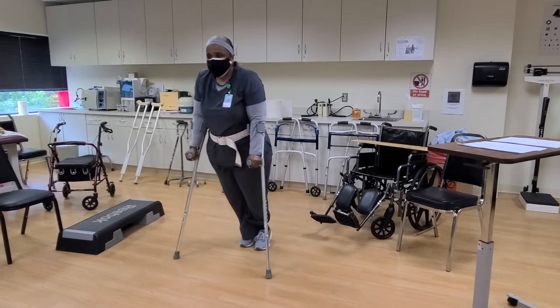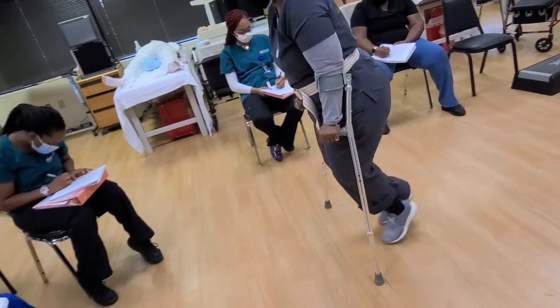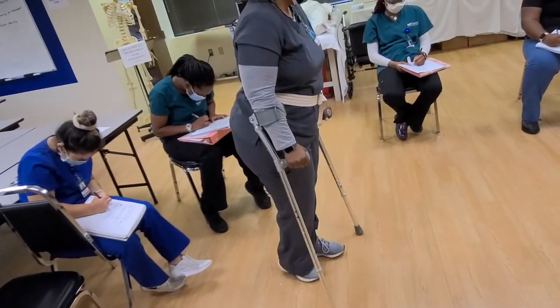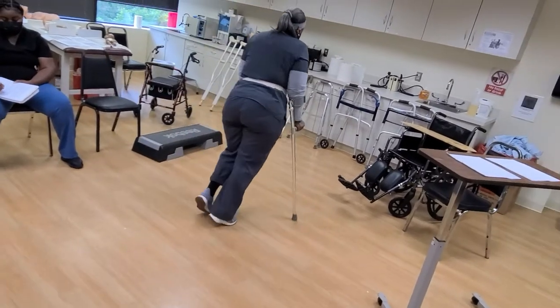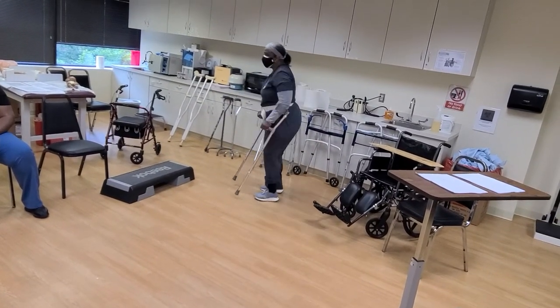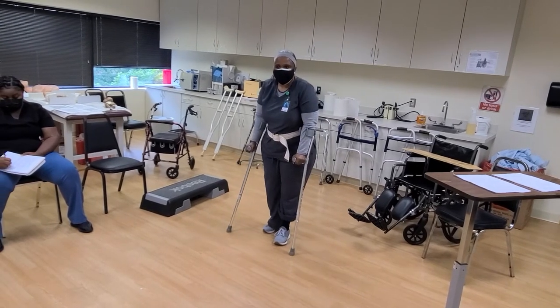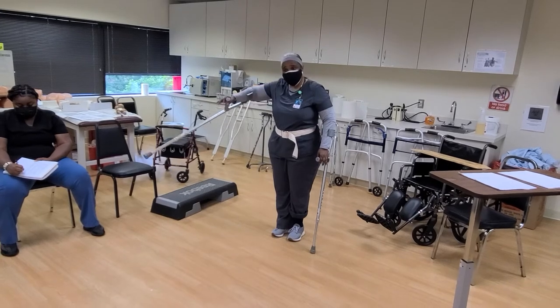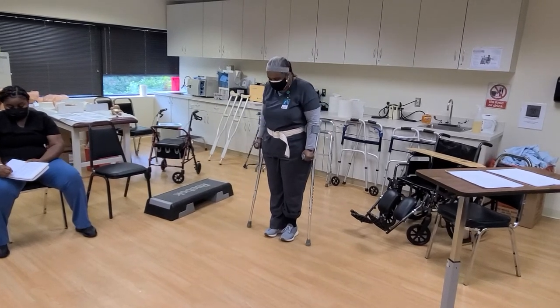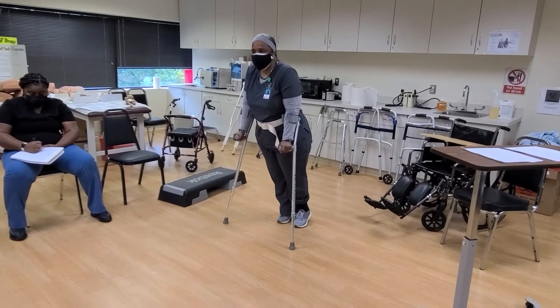I'm going to bring this forward and swing my legs through. You'll see little kids and they're flying — that's what you're doing. If you're paralyzed from the waist down, how are they able to walk? That's the beauty of it. Sometimes people just use one cane too.